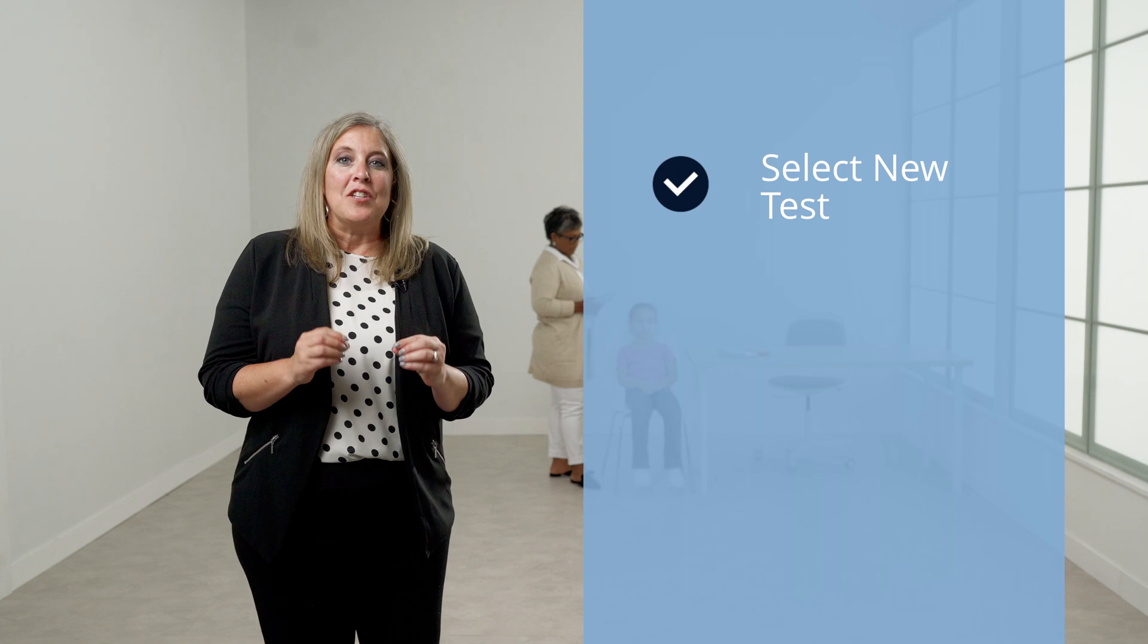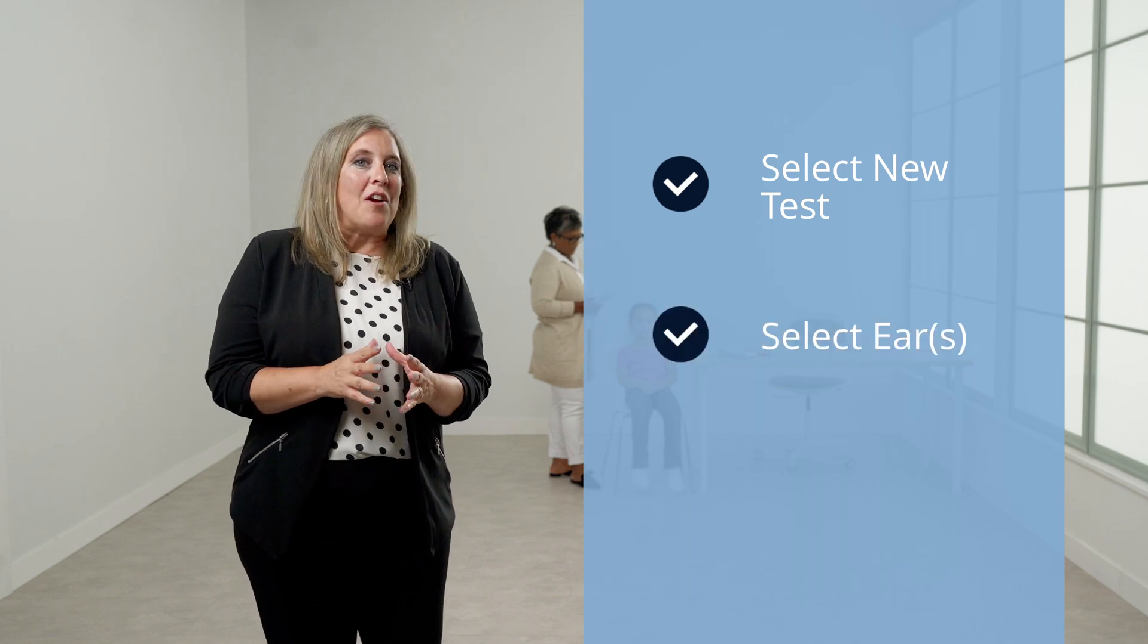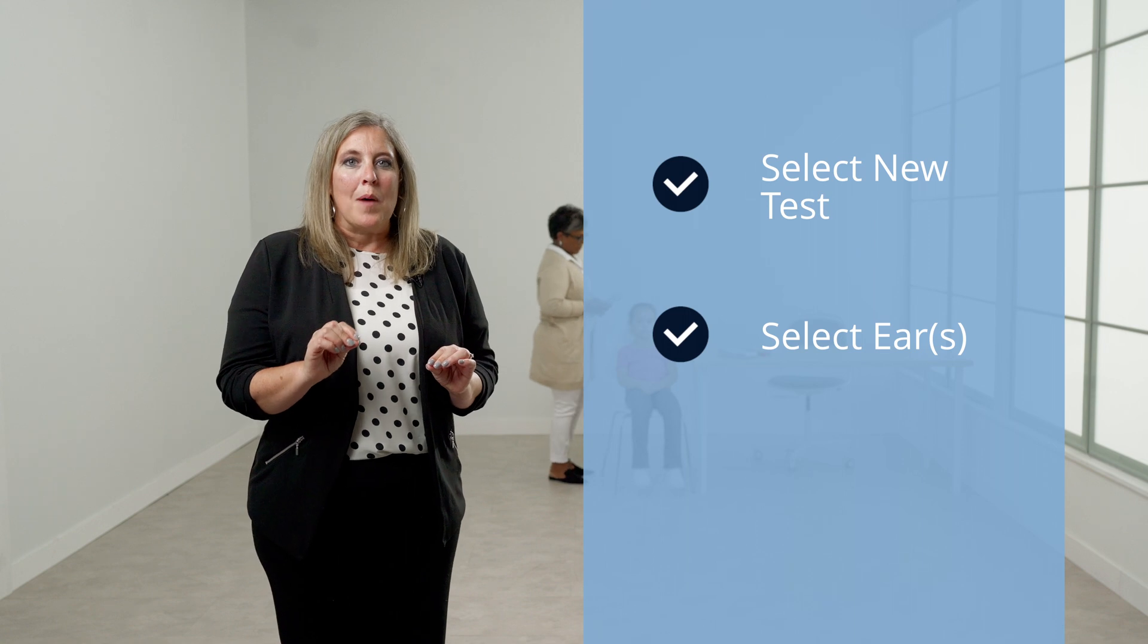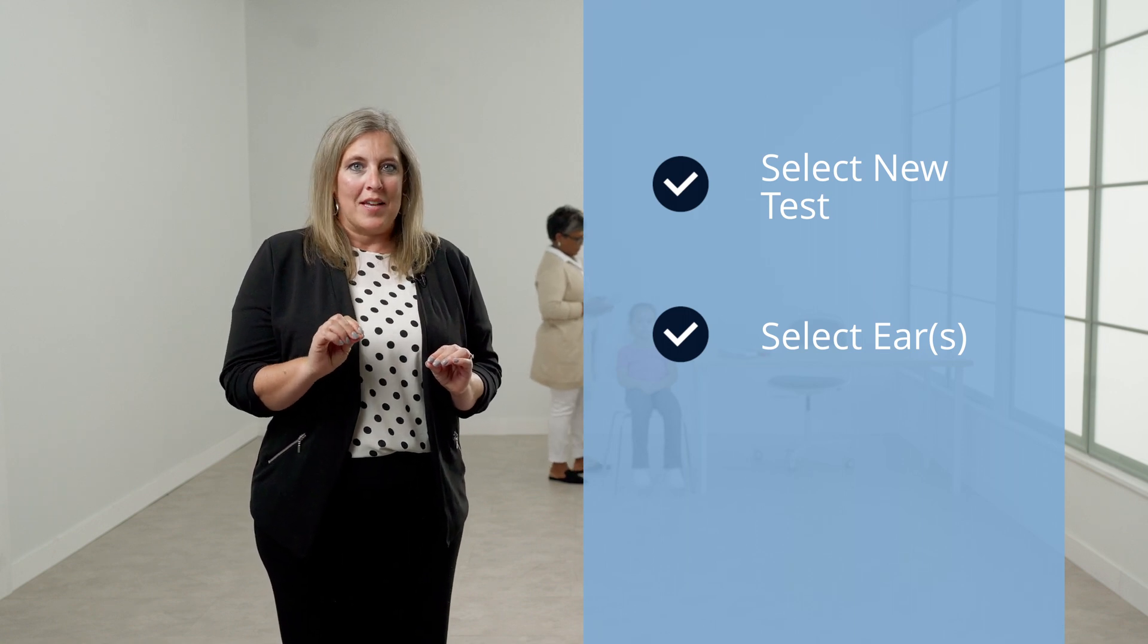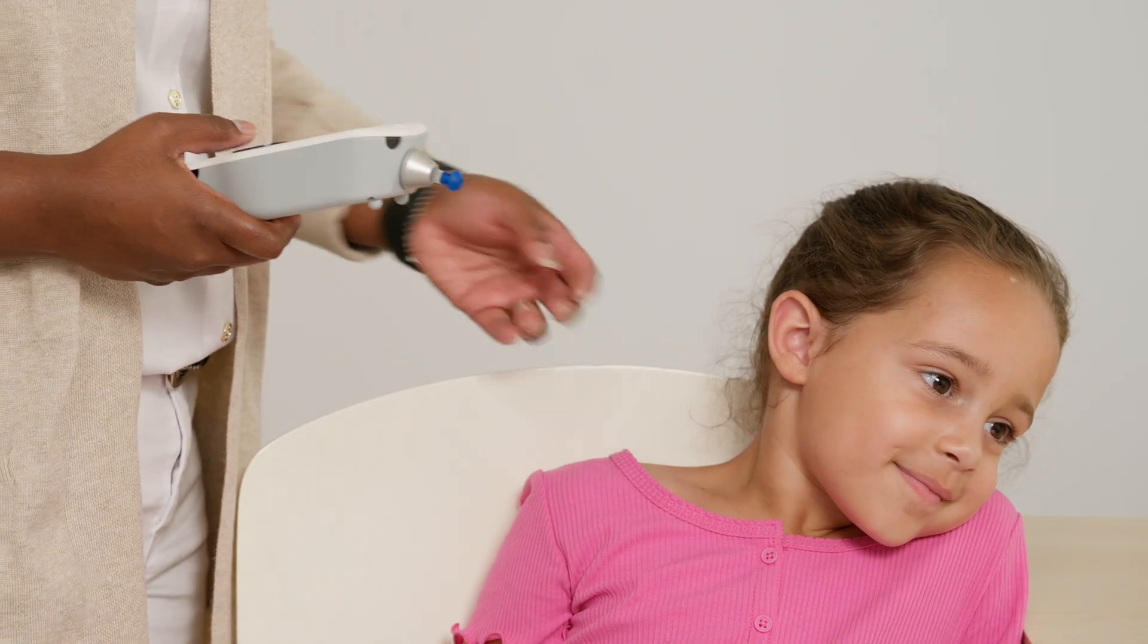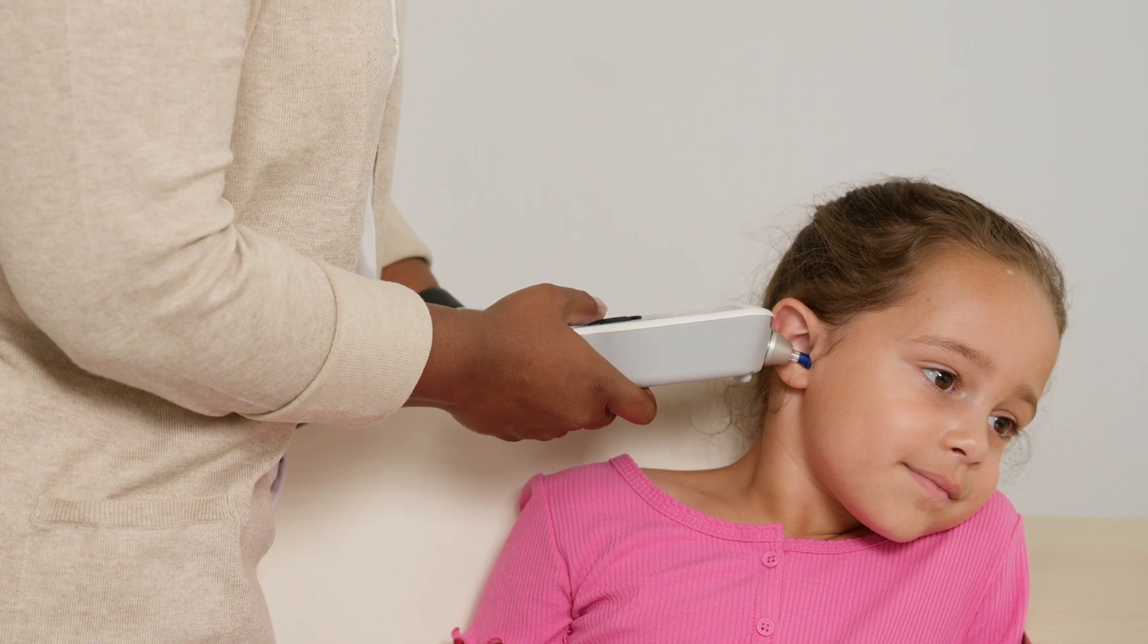From the main menu, select new test. Select the ear or ears to be tested. The Allegro provides visual prompts during each step in the test process. The first message is insert probe. At that time, you will insert the probe into the opening of the ear canal to obtain an air tight seal and hold the Allegro at that position for the entire test. Keep your eye on the display screen as additional messages will inform you of the status of the evaluation.